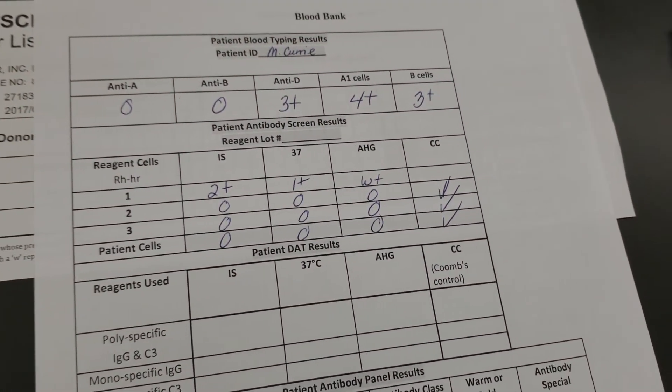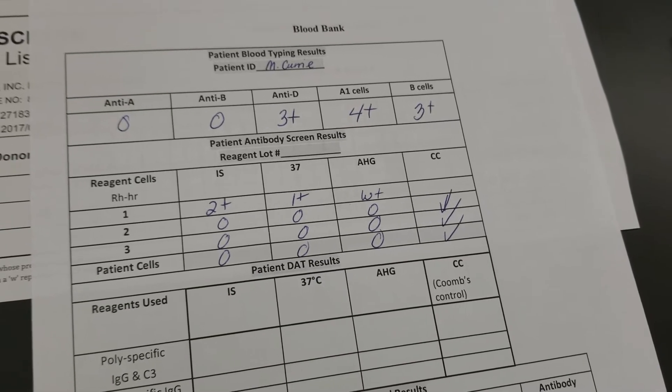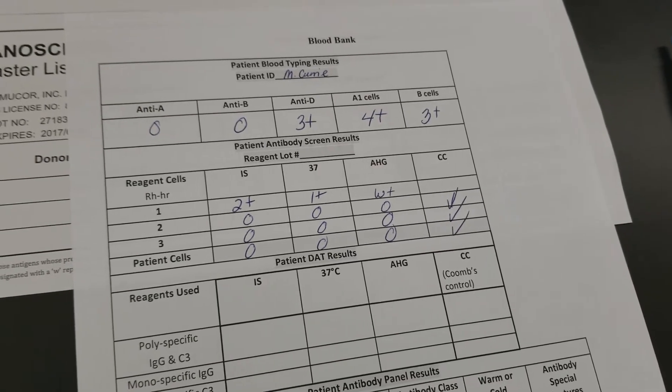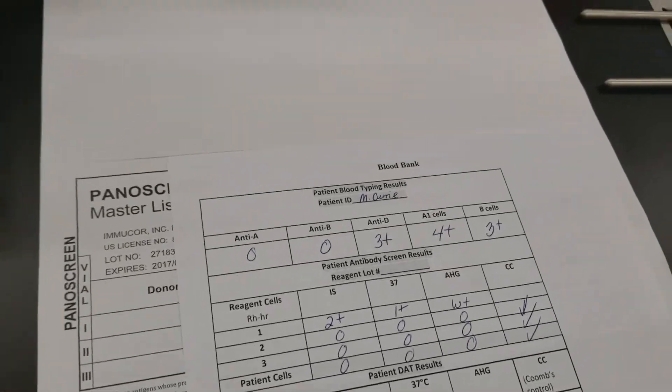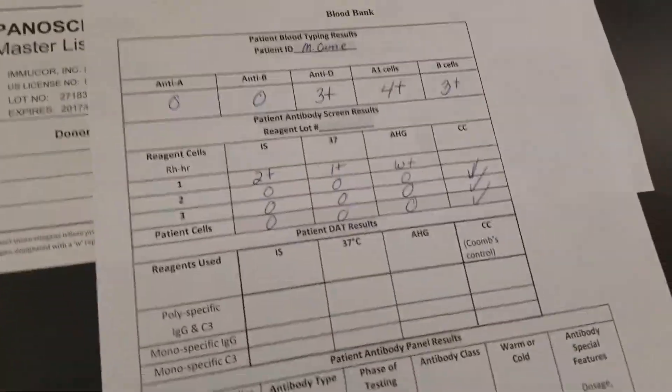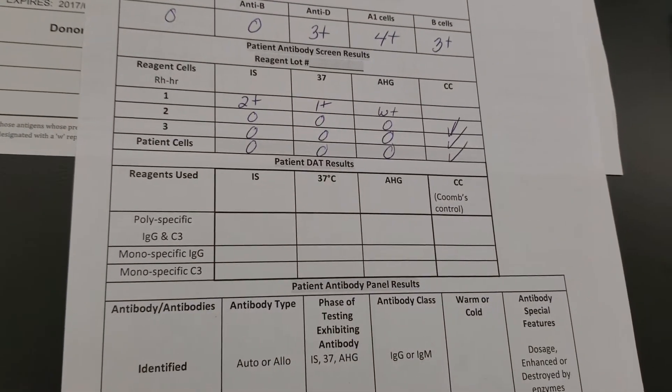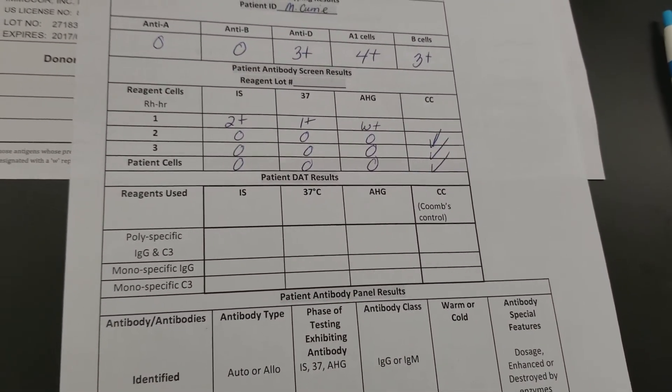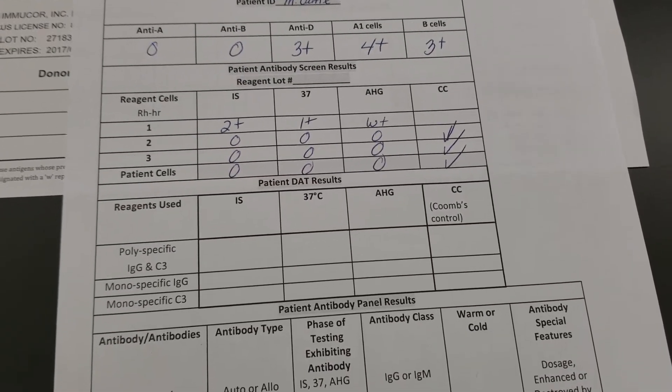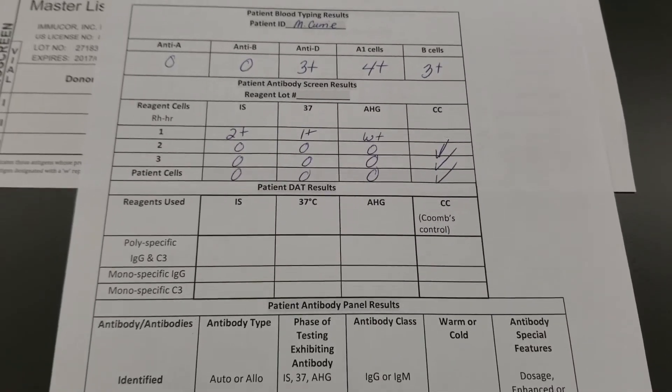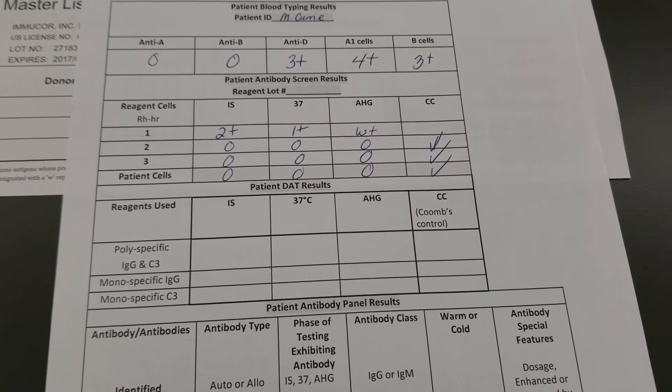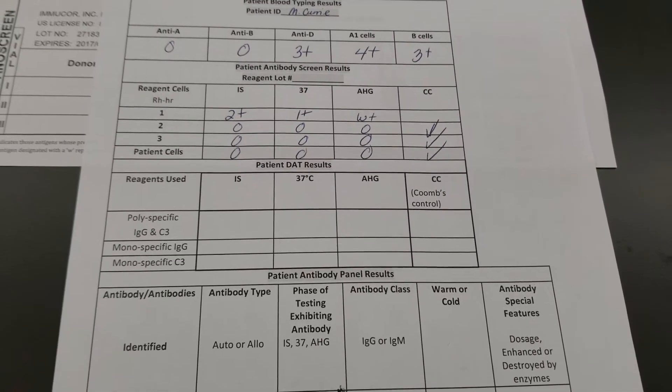If you look here, this is our patient and we have a positive antibody screen only in the one cell. We can look at the antigen gram later, and so we're going to do this now to see if we can identify that antibody. Notice we did not need to do a DAT, a direct antiglobulin test, because the patient did not have an autoantibody, so we don't need to worry about trying to identify an antibody or if there's complement coating the patient's own cells.